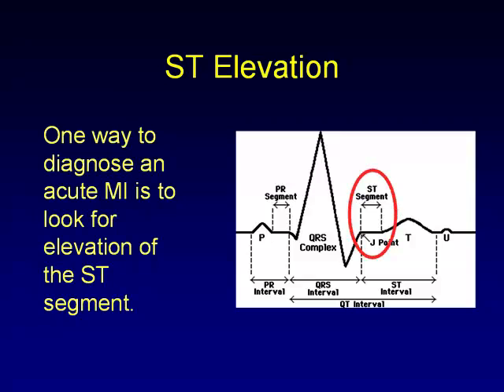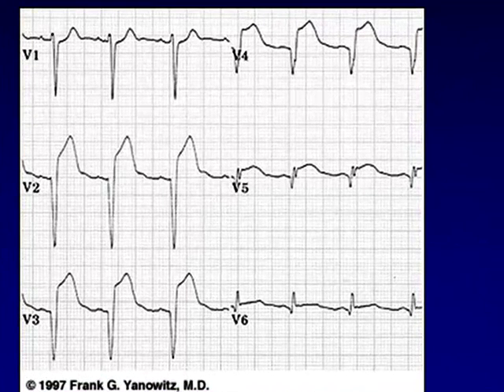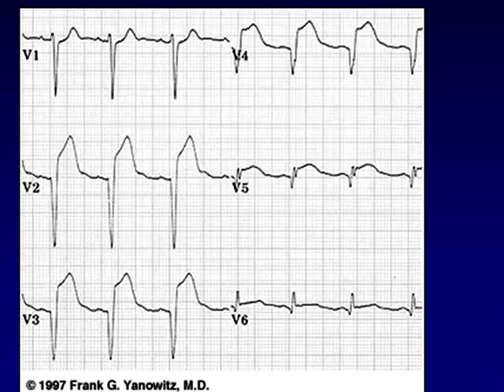And as you see very well here, this is the ST. If you see this ST is elevated in more than one lead, above more than one small square, this is a very, very important sign for myocardial infarction, okay? For example, here you can see very, very well an ST elevation. Can you see it here very well? Can you tell me where? Just stop the video for a while and tell me.